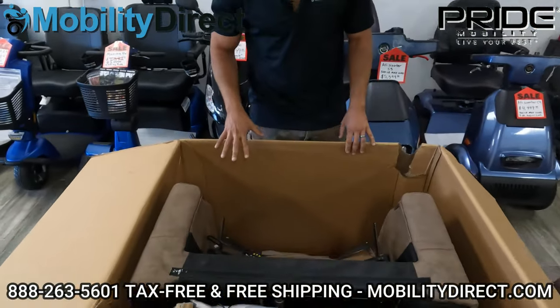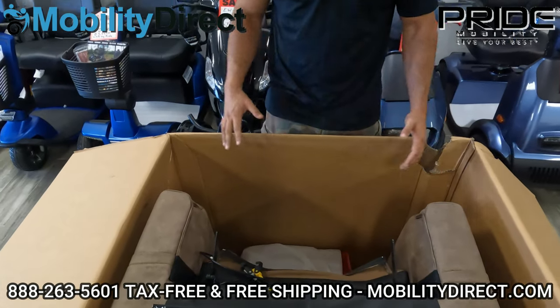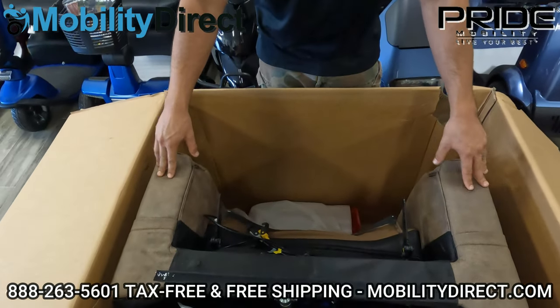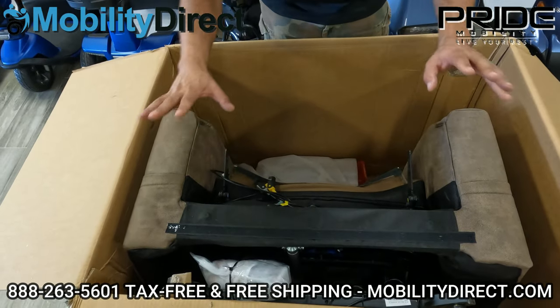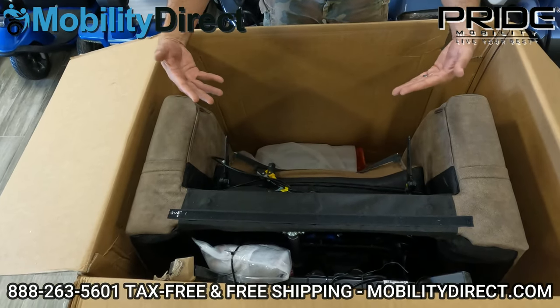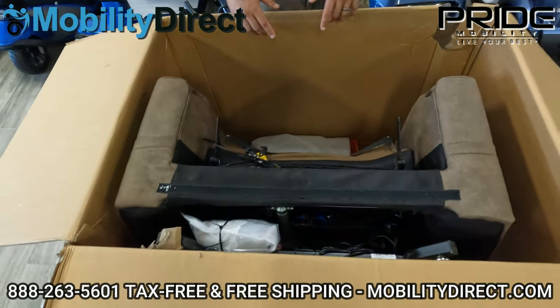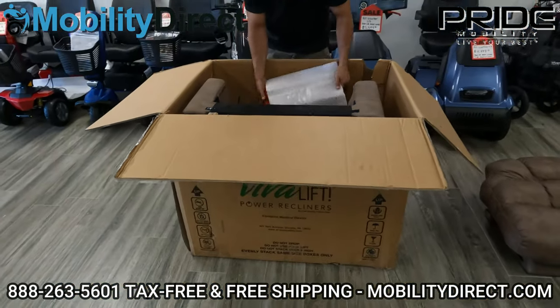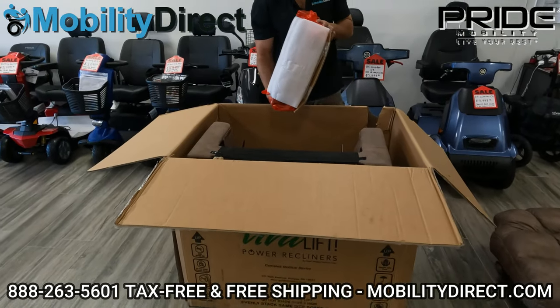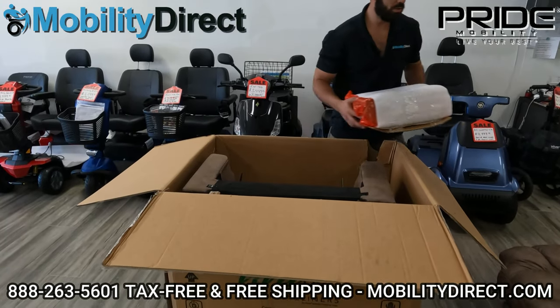Pay attention here. What you're going to want to do is identify the orientation of the base — the legs are down here. If we push it forward, it's going to be sitting on its legs, and that's what we usually do when we take these things out of the box. I'm going to reach down in here and grab the side pads, which go on the sides of the backrest. I'll show you how to install those in a bit.